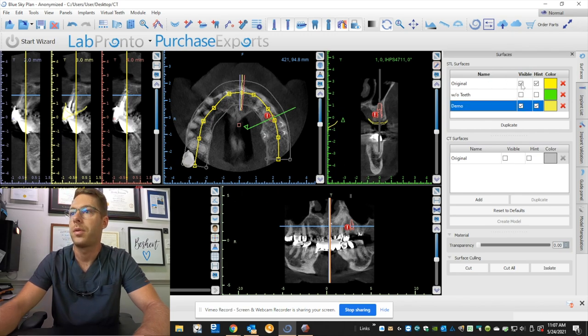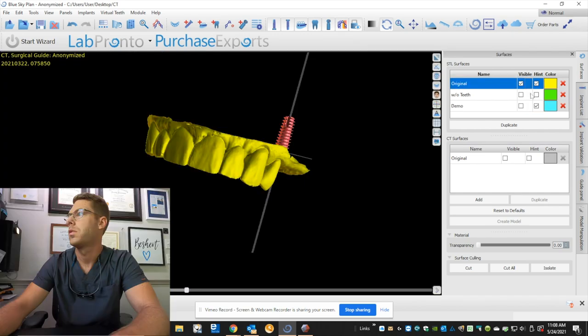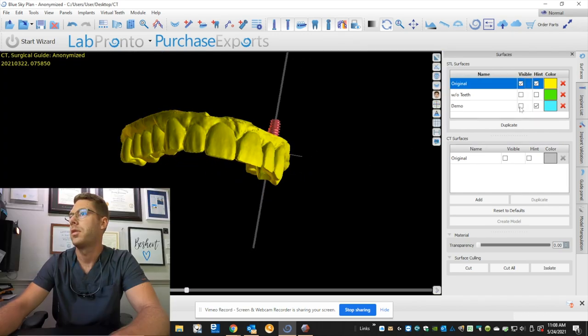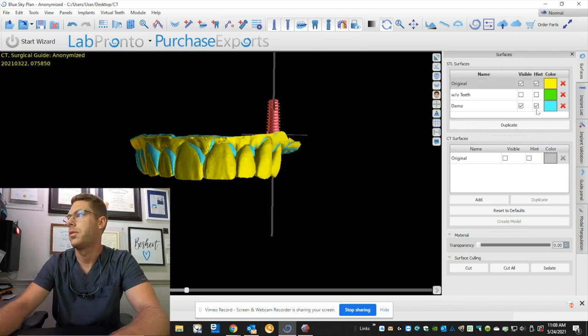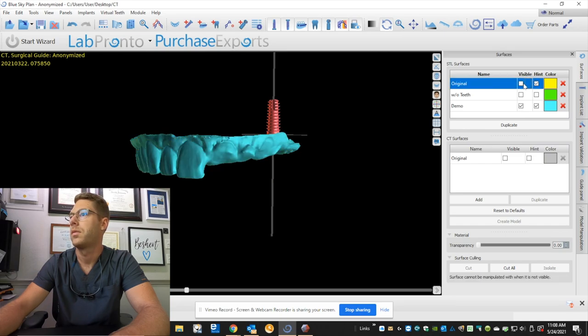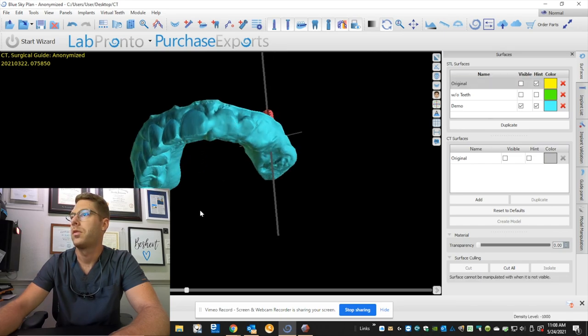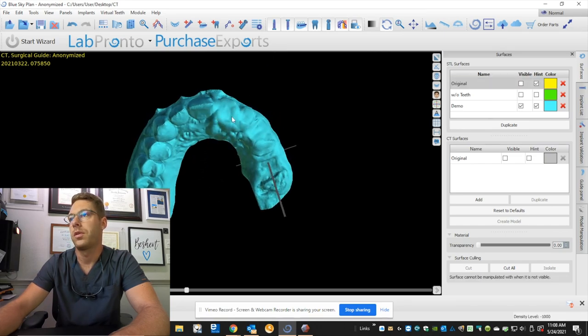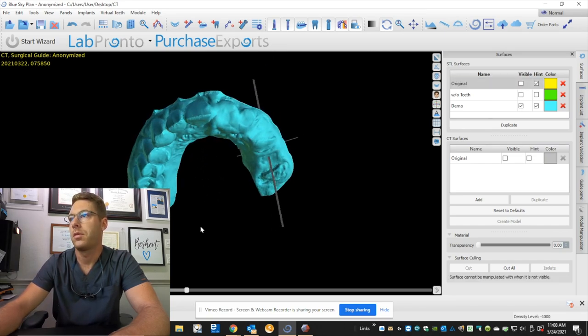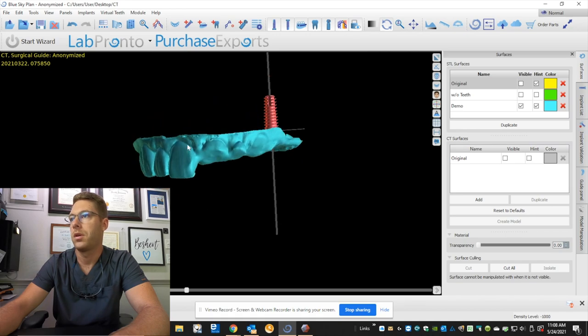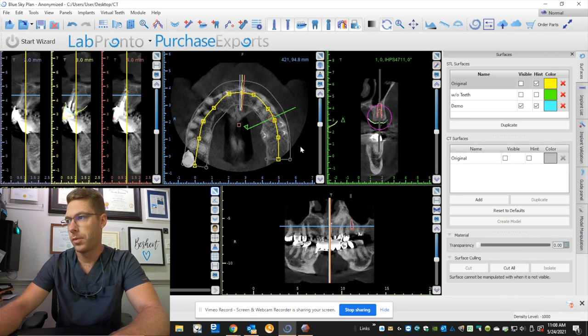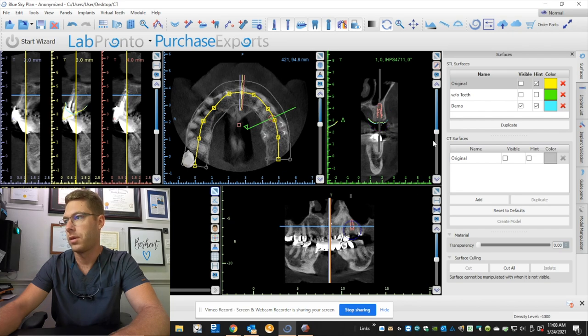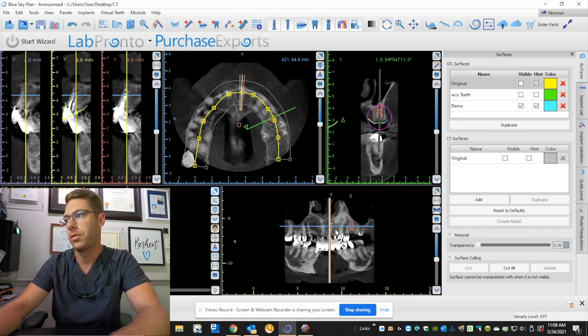Okay, so here is my original, and then here is the model without teeth. It's simulating what it's going to be like after the extractions. I know I'm gonna be placing three teeth here, so let's go ahead and plan these implants. I'm gonna start with number 10.